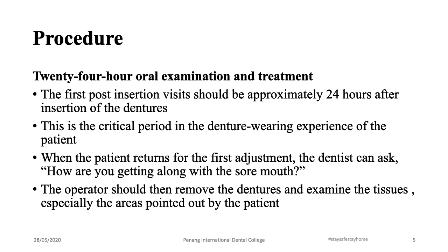During this procedure, it is a very critical procedure because you are doing minor adjustments and eventually giving a final, completely rectified denture which he can use for the next few years. Probably for the next 5 years he can use these dentures without any problems. So that is the main goal in this treatment or in this appointment.